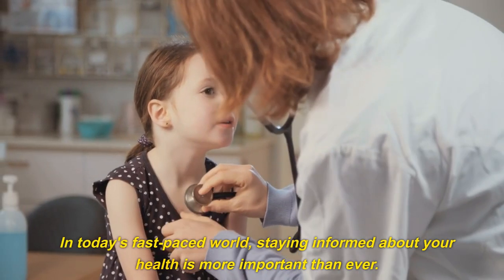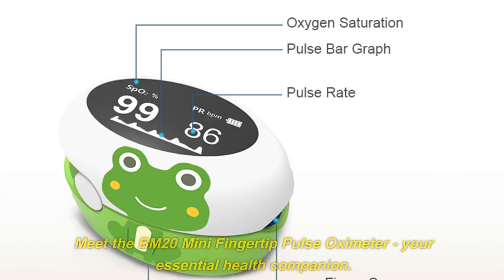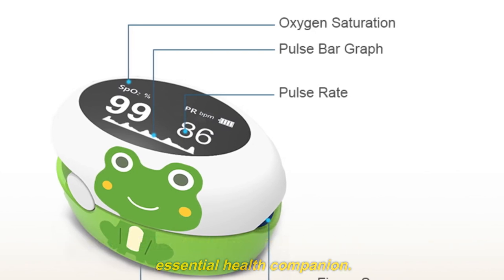In today's fast-paced world, staying informed about your health is more important than ever. Meet the BM20 Mini Fingertip Pulse Oximeter, your essential health companion.